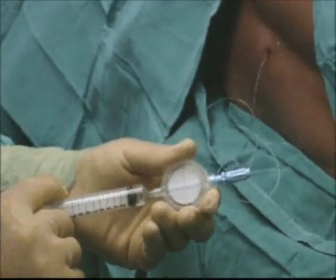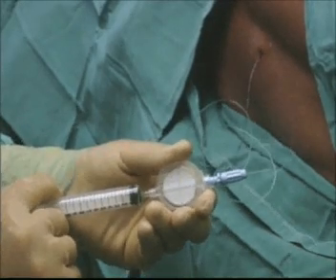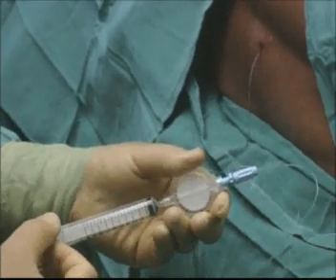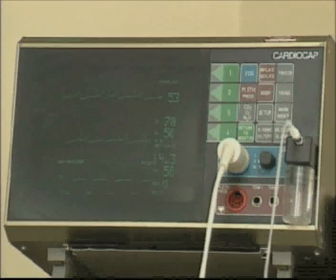Once the catheter position is confirmed by the Tsui test, a test dose of local anaesthetic with adrenaline can be administered through the reassembled connector and catheter. Gently aspirate the syringe to ensure that no fluid flows back. The patient's heart rate should be monitored closely, as an increase will indicate incorrect positioning of the catheter. Other signs of toxicity, such as hypotension, should also be monitored closely.